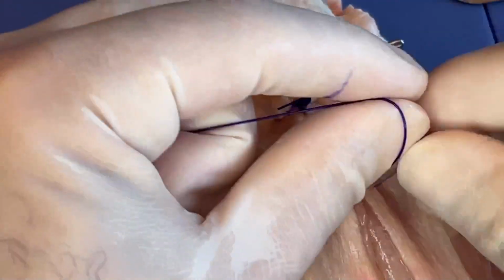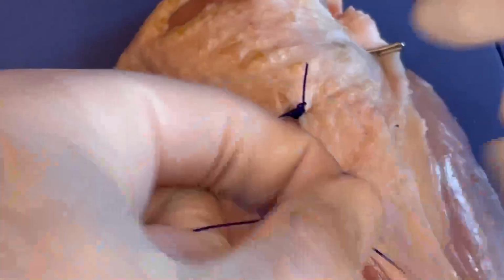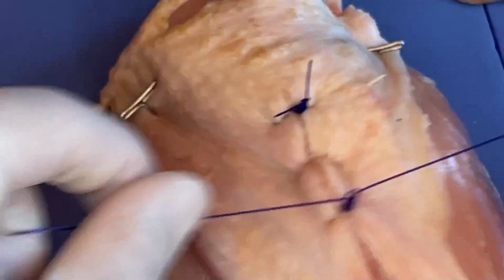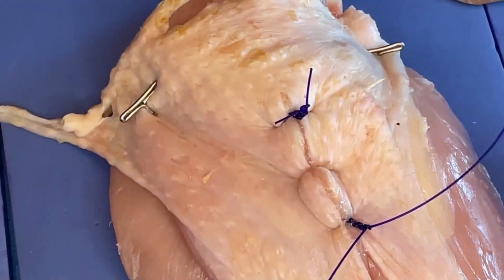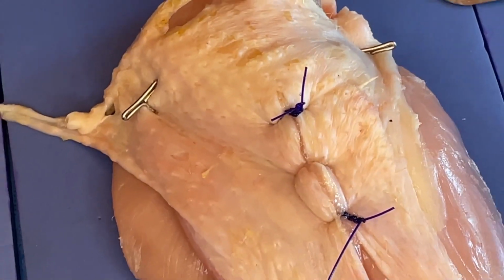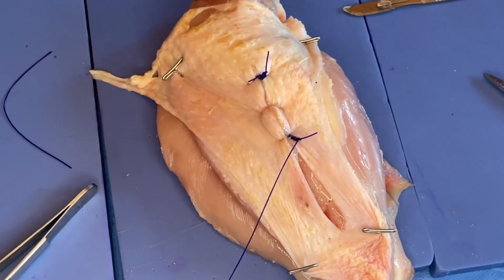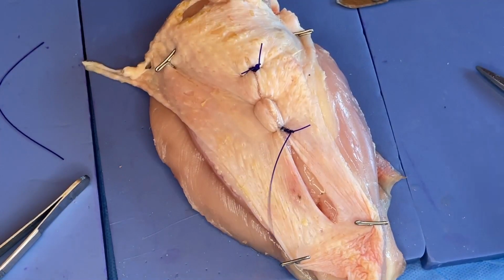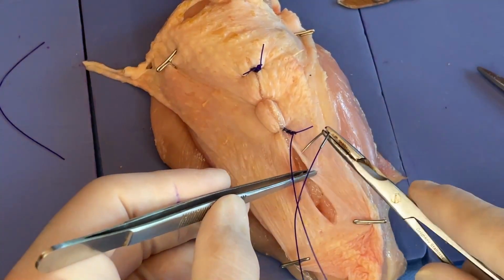So again, thumb first, finger, finger. All right, so actually let's do this as a little bit of a running. Back off our zoom there a little bit. So if I was using this to close fascia, I would do this as a running.